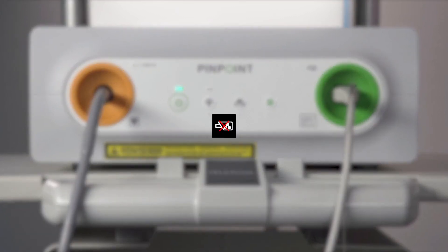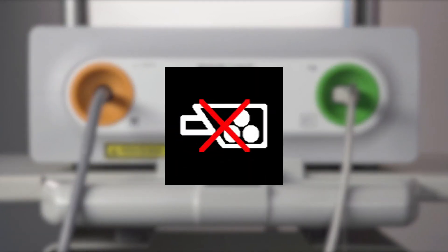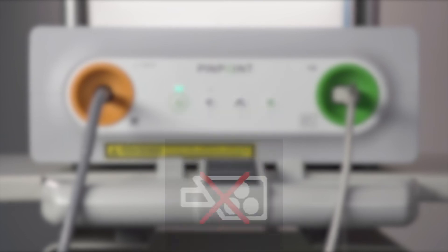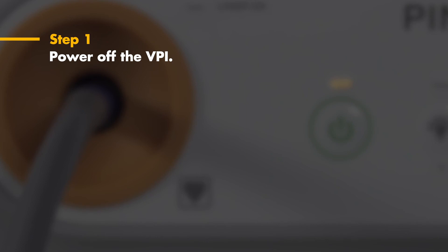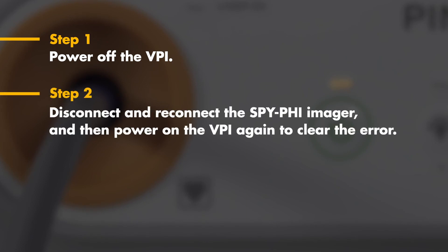Failure to do so can result in this camera connection failure icon. If this occurs, follow these three steps. Step one: power off the VPI by pressing the power button on the front panel. Step two: disconnect the camera cable from the VPI and reconnect it. Then power on the VPI by pressing the power button on the front panel.